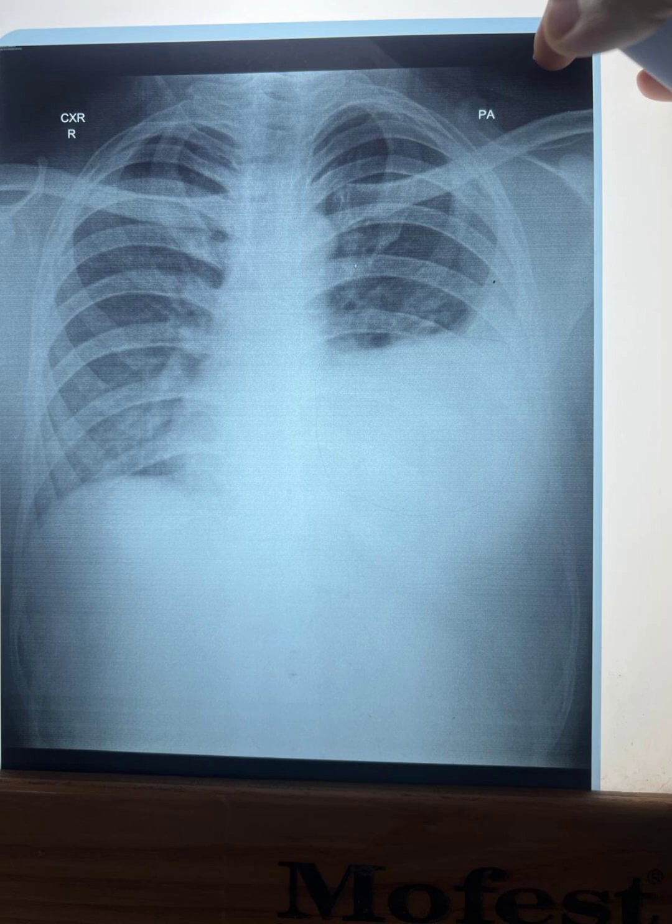And its mediastinal relation always depends upon its size. So if it is large, it will push the heart and the trachea away from the center, and otherwise it will just lead to same side costophrenic and cardiophrenic angle obliteration. And it will be a homogeneous opacity with no intervening other signs, as it is outside the lung parenchyma.